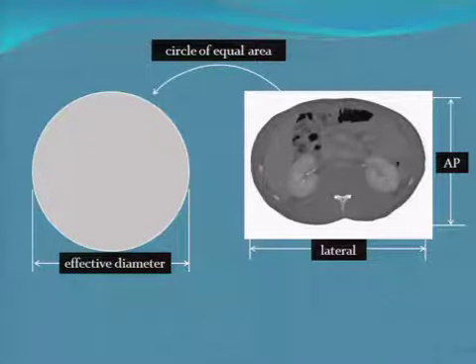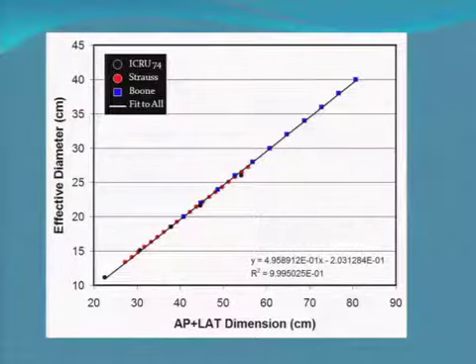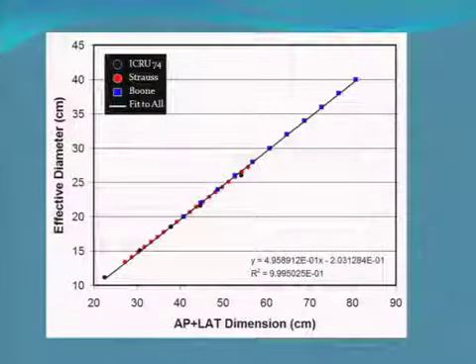So how are we going to use that? Well, we have to come up with some size metrics that we can actually use in the clinic. And the report includes several options here. One is an AP and lateral dimension of the patient to try and put that into effective diameter type units, which you can do if you have both dimensions. And if you do two scouts on a patient, you can get both dimensions. If you do the lateral and then the AP, or in whatever order you want, you can pick these right off the scout. Sometimes you can pull them off the axial image, but that sort of assumes that you can see the skin line all the way around, and sometimes you can't.